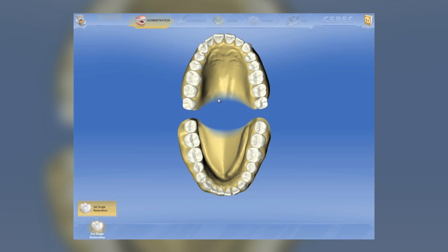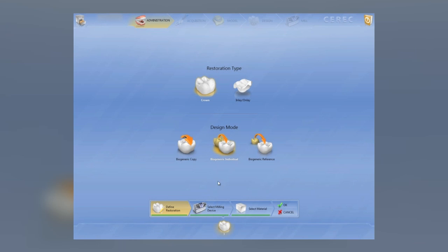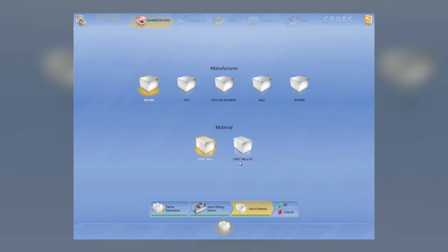As you can see, the workflow is very different. In the administration tab, you select the tooth you're going to be working on. You can also select the type of design and the type of restoration you want to utilize for the case.